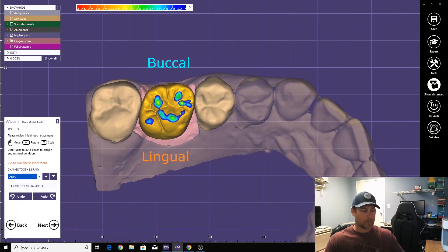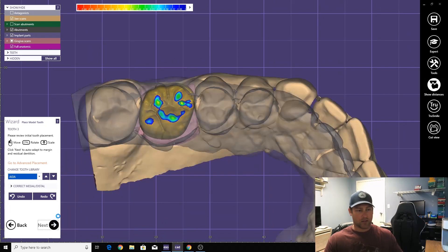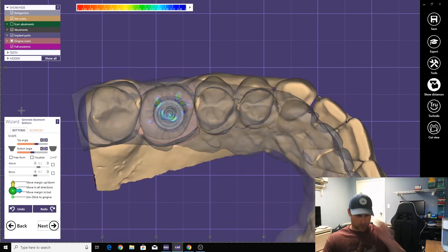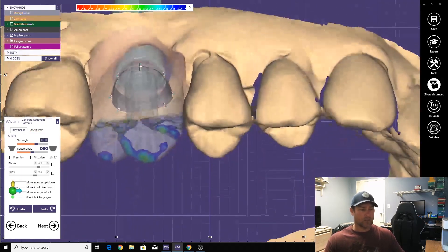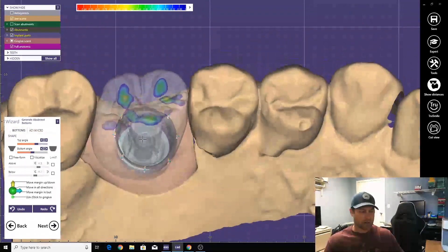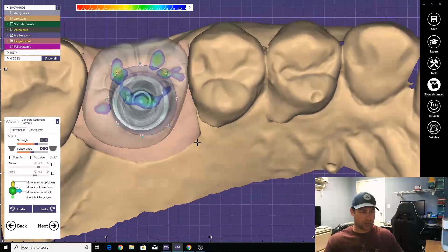I'll go out a little bit more. All right, emergence profile.